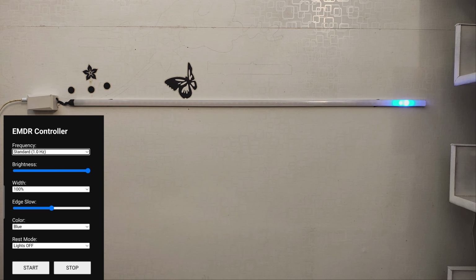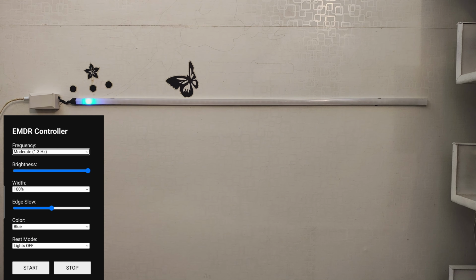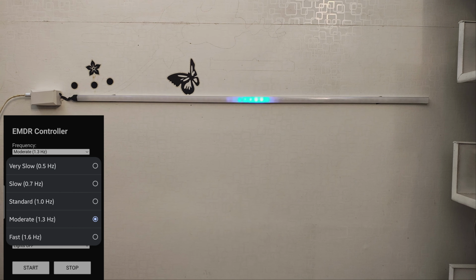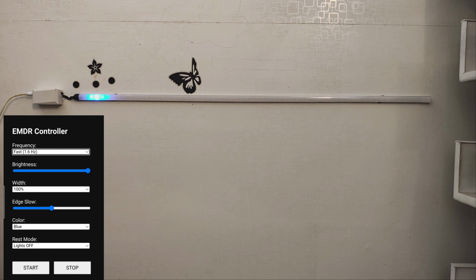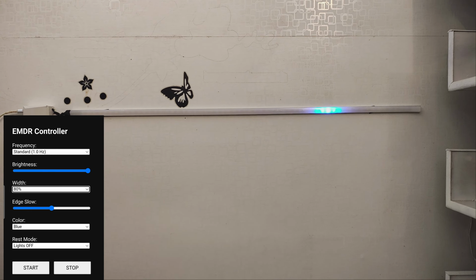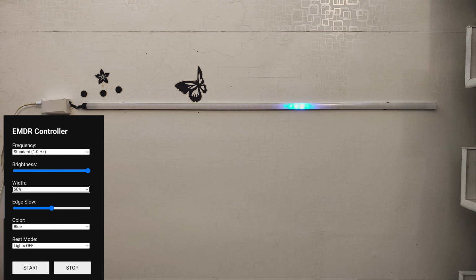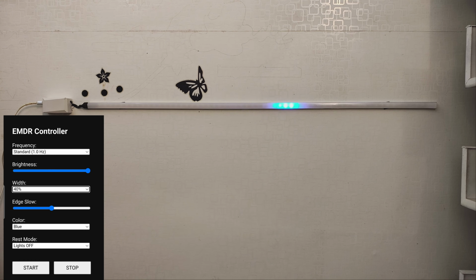Now let us experiment with 1 Hz. It is the standard EMDR rhythm and it is best for general EMDR sessions, balanced stimulation, and medium activation. 1.3 Hz is the moderate speed. It is for clients who feel stuck and are facing intense processing. Then I can experiment with 1.6 Hz as well. I can change the width depending upon the client's level of comfort.